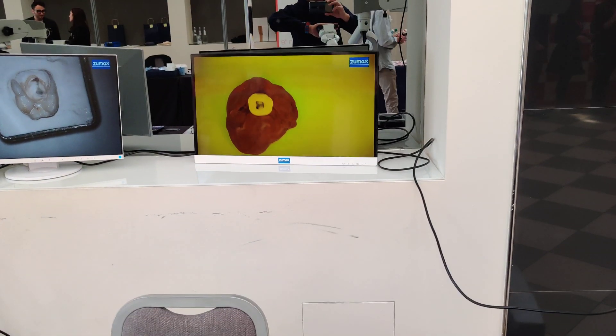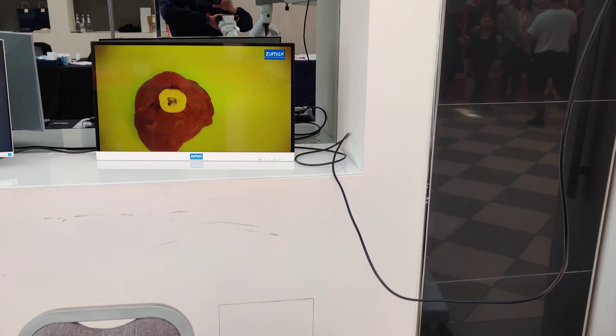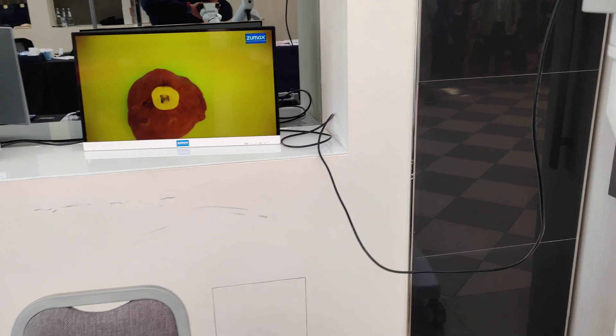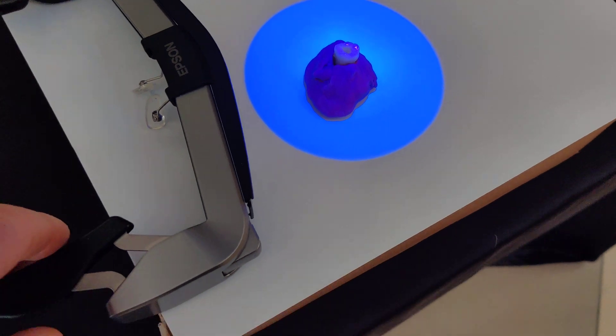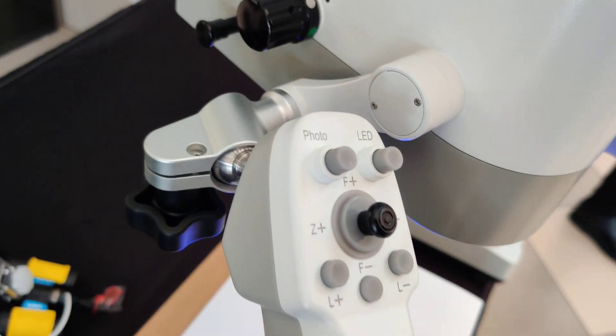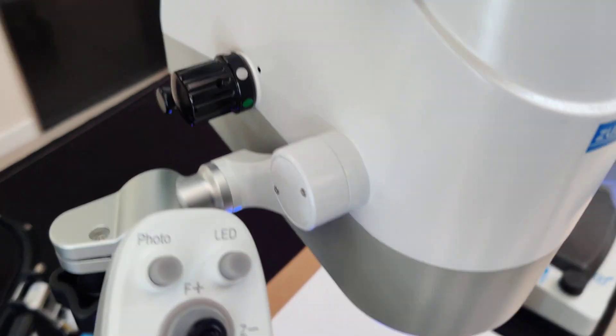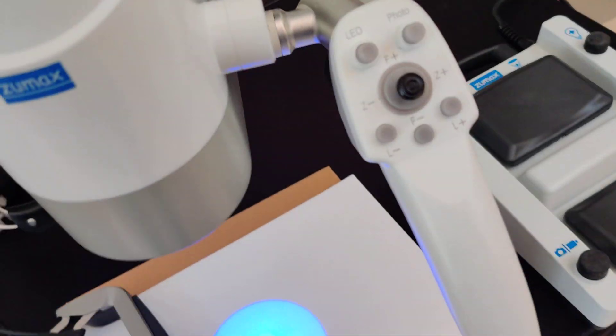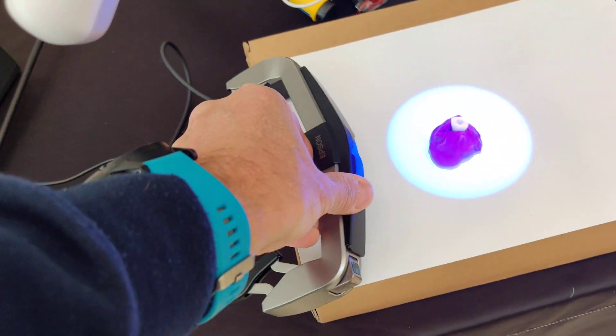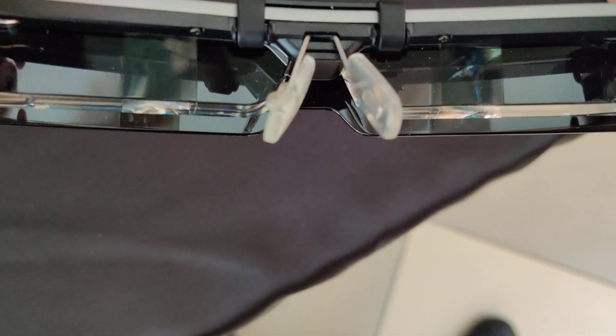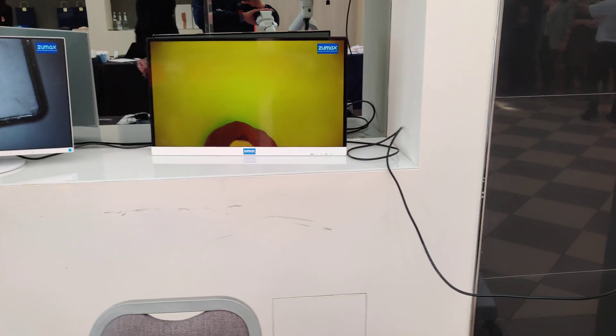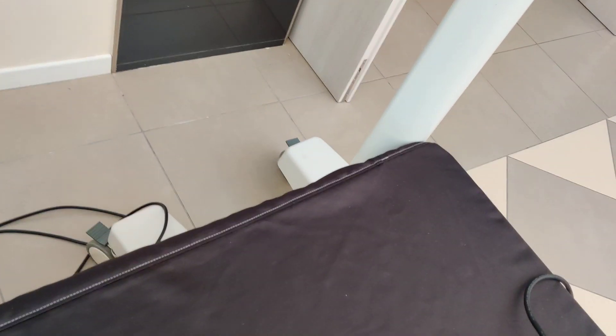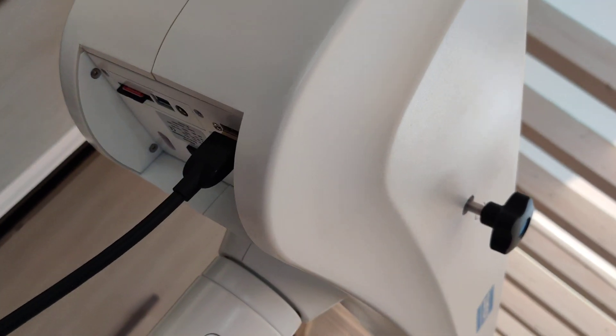And the controls and the colors on the video is excellent. So this machine is having the video camera inside with the 2D and 3DS. This is the reason why we can connect with the Epson glasses and see the 3D images from here, or we can connect to the video that we have here in 2D, because we have two exits. One is close to the base for the 3D, and the other one is here, HDMI.